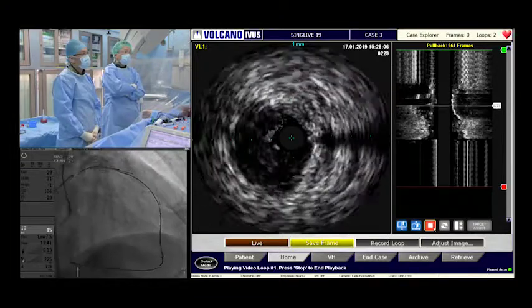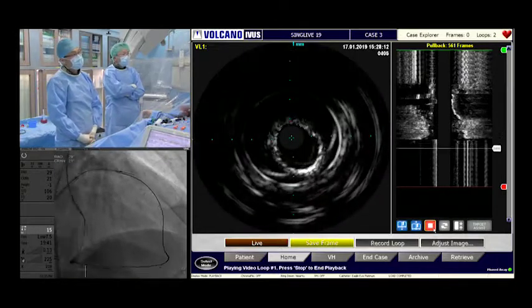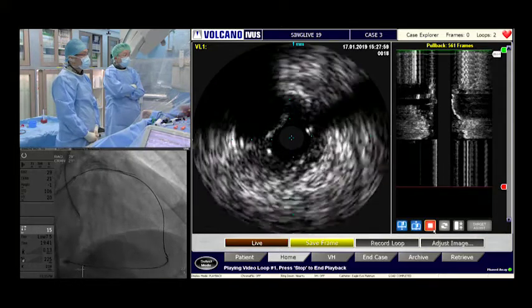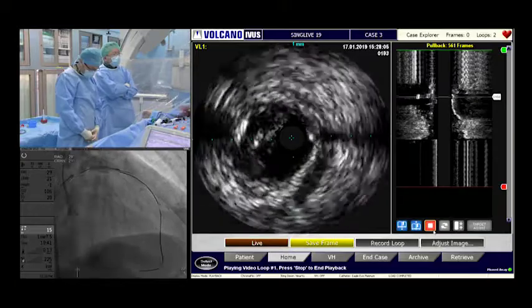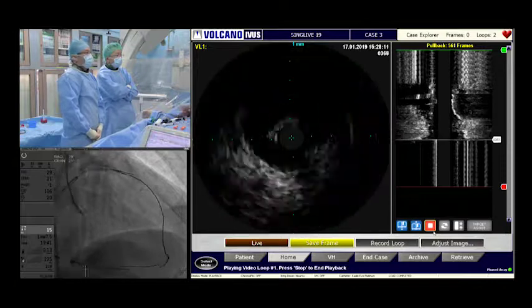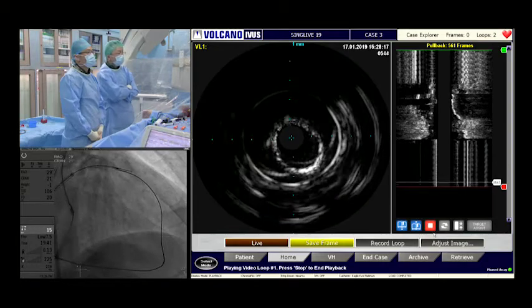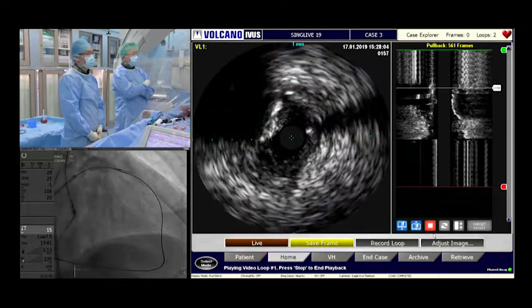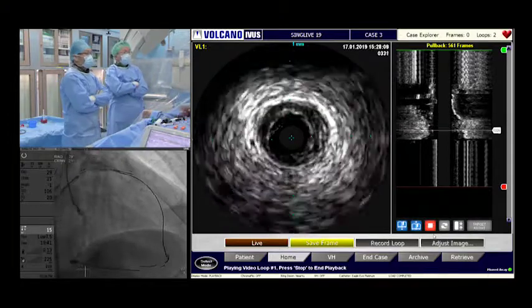So, I mean, this is one of the difficulties when you have a long segment of CTO, that you can get in the right plane and then go out again with the stiff wire. And this is why Guideliner and reverse CART has become popular, because it sort of prevents this. It's a little bit more difficult to do in the LAD because of ischemia, but sometimes do ballooning and just advance the Guideliner, and of course it sort of overcomes this problem. I know many people love Guideliner. Okay, that's one option.